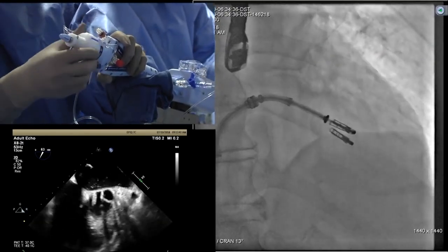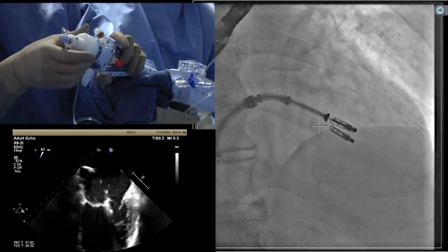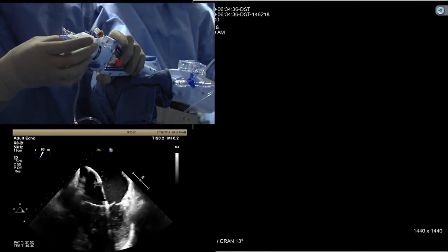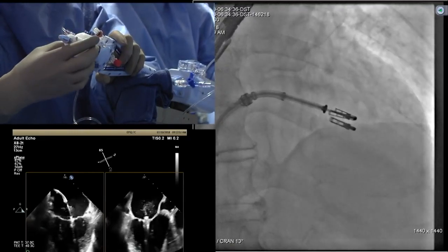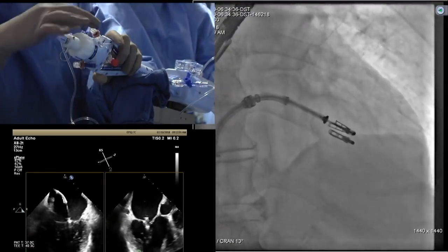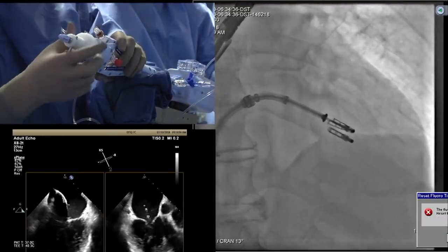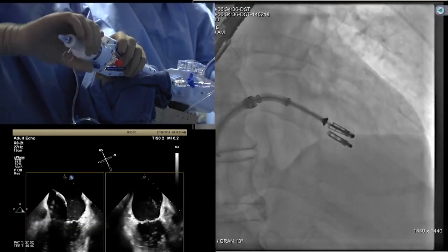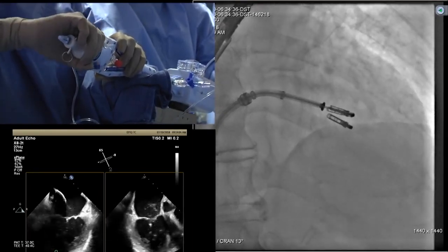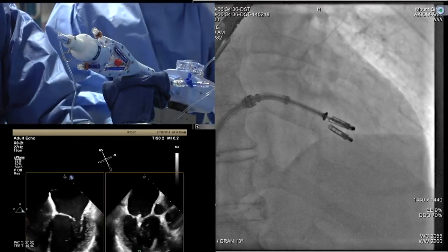Okay, so we're going to lock, unlock, right? Open and then close completely. Flashers are on, right? Oh, it opened a little bit. So close again. Why did it open? Because I think that we didn't lock the clip before. I hope it will not open again.